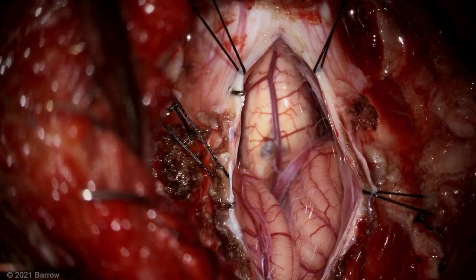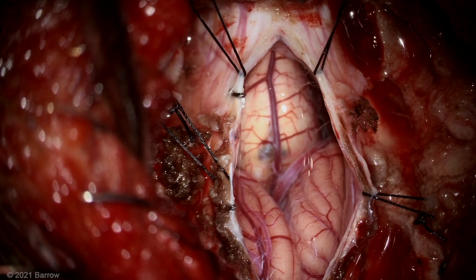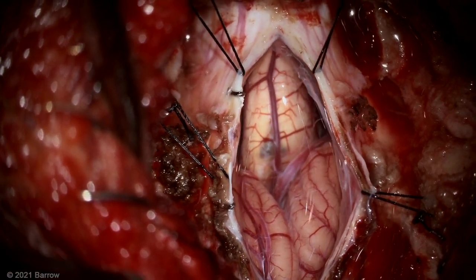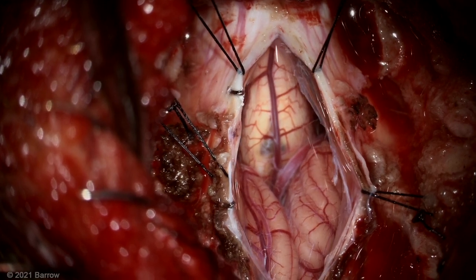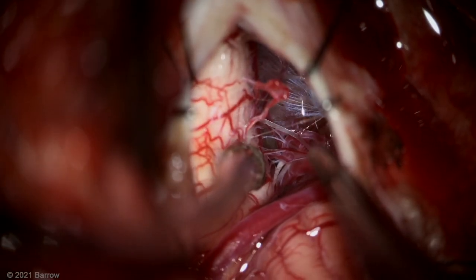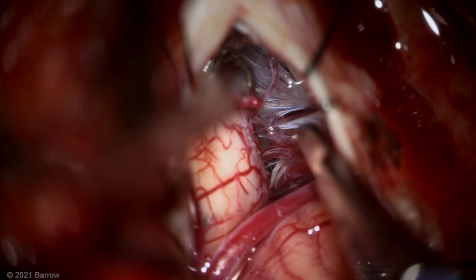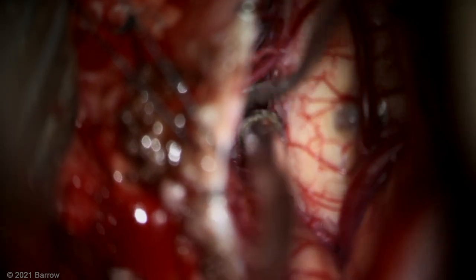Here is an overview of this mini suboccipital craniotomy. You can see that a simple midline incision is all that is needed, giving nice views into the gutters just below the tonsil. Here we see the dentate ligaments and contributions to the accessory nerve, and on the other side, a nice view of the vertebral artery.